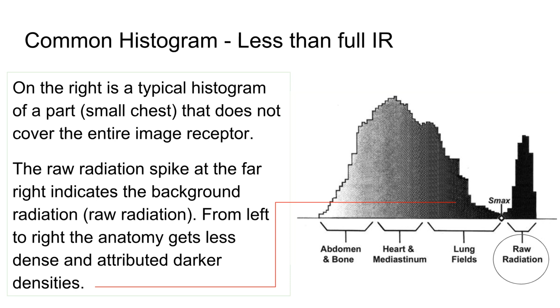If that darkness is not picked up, it will try to lighten up the entire image and treat it as if it was anatomy, when it's actually raw radiation.